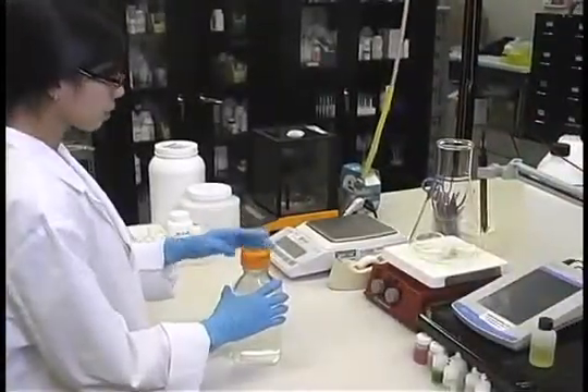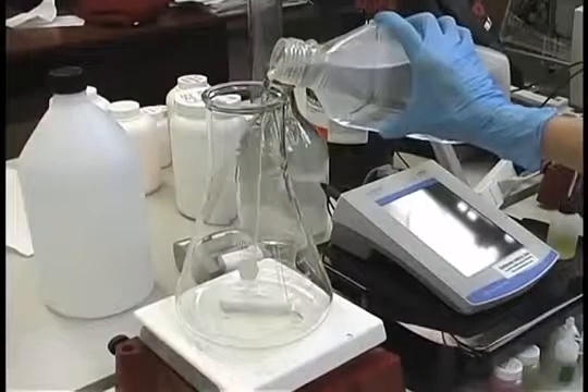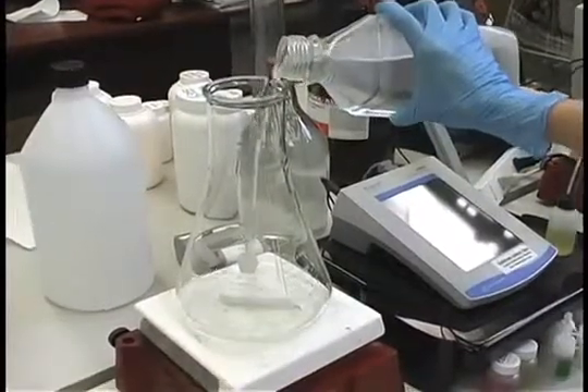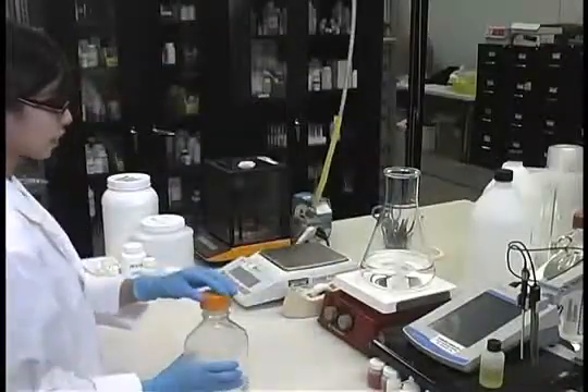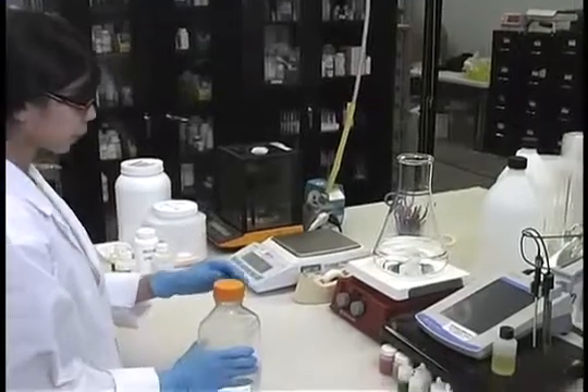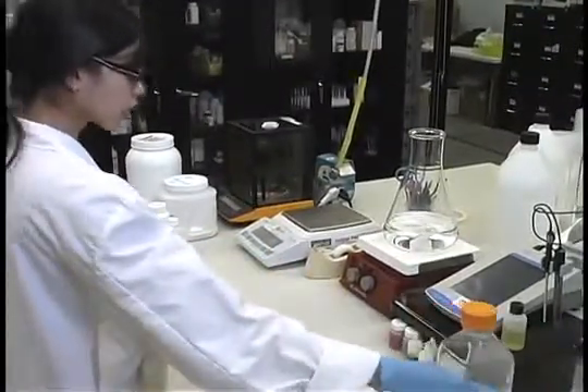Measure out 80% of the final volume of water that is required for the batch of media being prepared. Be sure to use tissue culture grade water, or product number W783 if you do not have access to tissue culture grade water. Add the water to a container that can hold at least one and a half times the batch size of the medium being made.